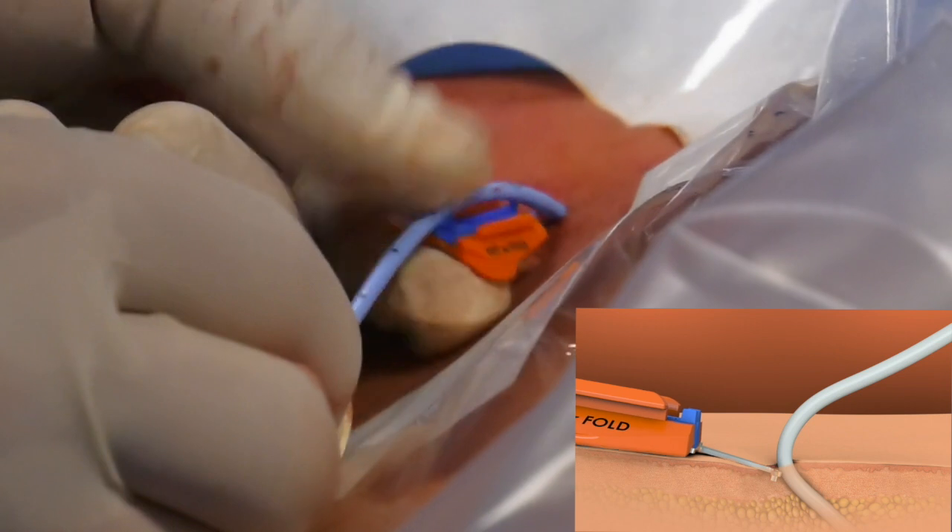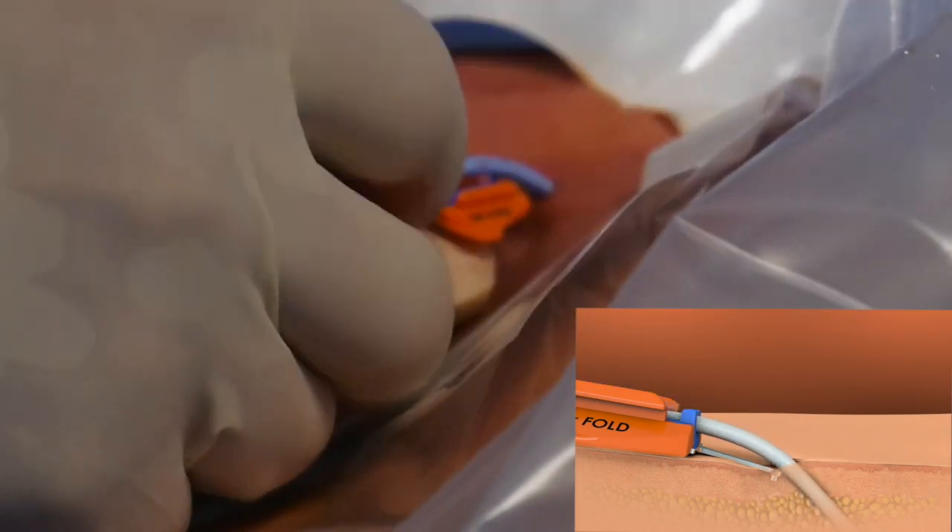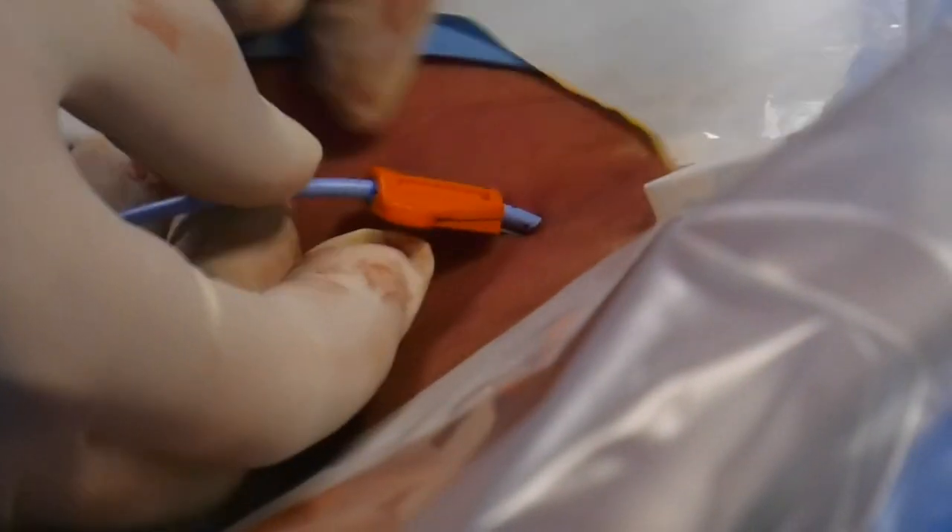Press the catheter into the groove and base, making sure the catheter shaft and SecuraCath base are dry. Place the cover on the base by pressing firmly on the center and then the edges. Visually inspect to make sure the cover is fully engaged with the base.